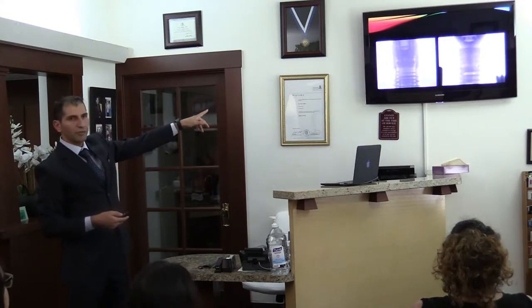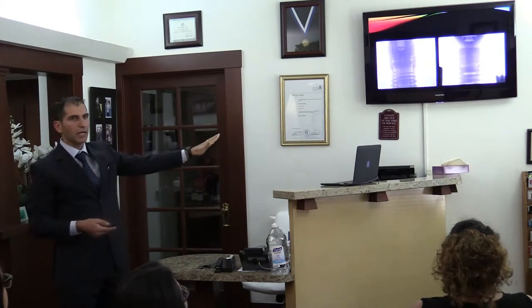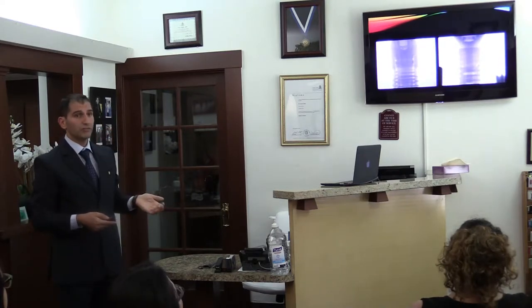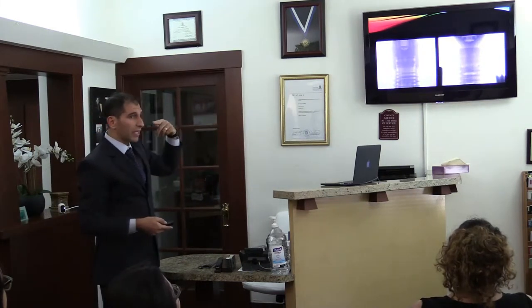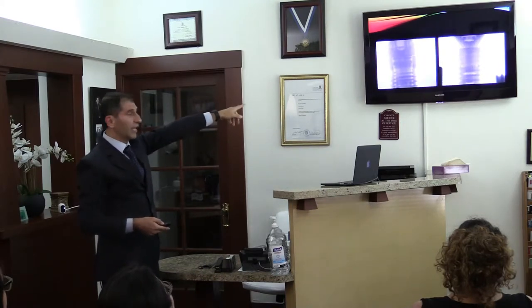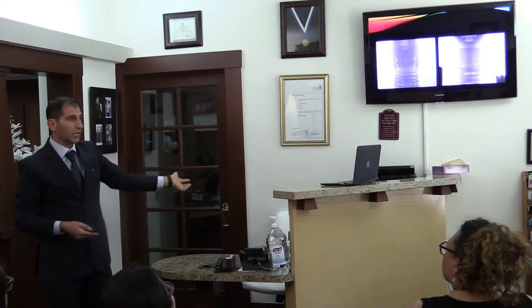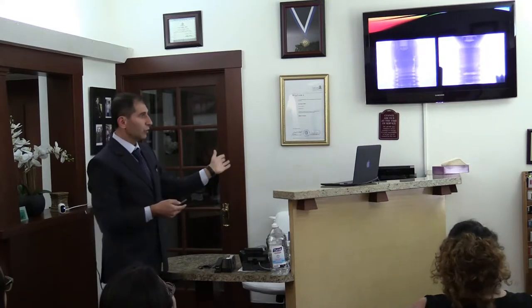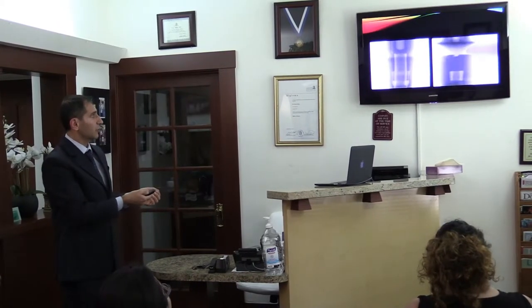So this is a butt joint type of connection. These are all famous implants. If you utilize those in your office, I'm not going to make a lot of comment, but I want you to see the difference. This was done at the University of Frankfurt, some type of radiovideography, and I don't want to be here. That's a big gap. If I can see it with my eyes, there is no problem for the bacteria to pump in and out. I'm going to have bone loss here for sure. So if you're utilizing this type of implant, your patient is going to get bone loss and tissue problems for free. Yes? You're not going to charge them for that. So we have to have understanding. And we don't know; some of the good companies have this connection.